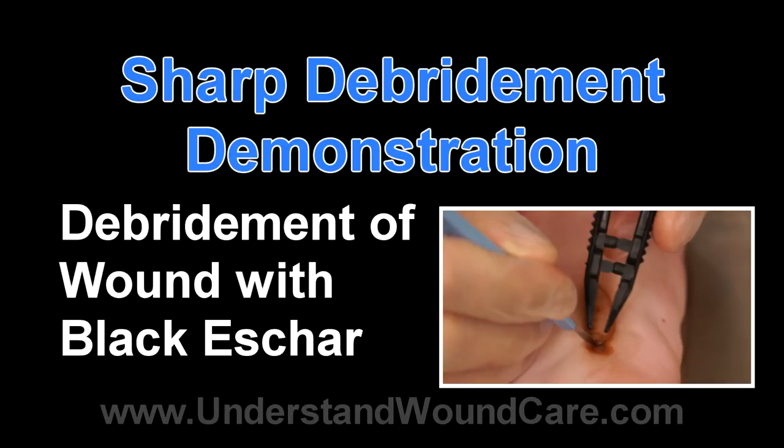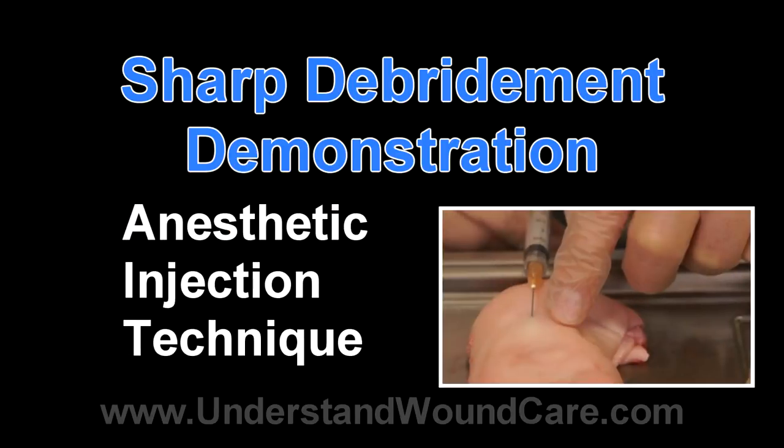Initially in this demonstration you will see a pig's foot and a demonstration of the correct method of anesthetizing with injectable anesthetics such as lidocaine. Additionally, a topical anesthetic may be used.